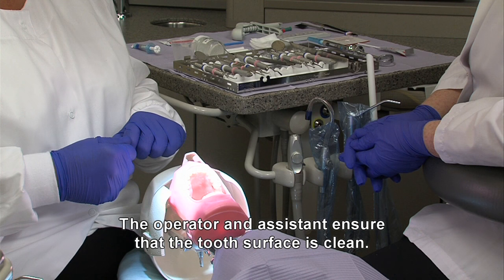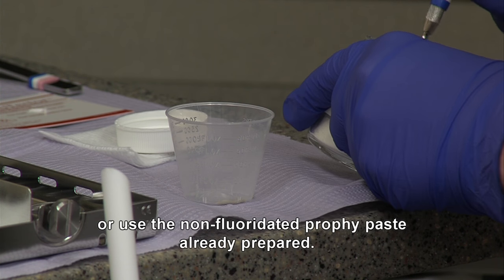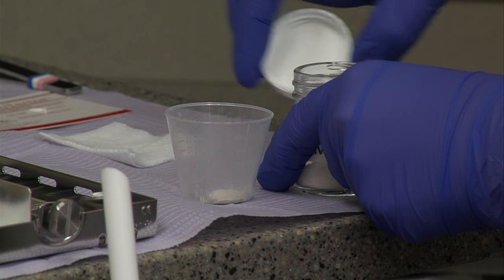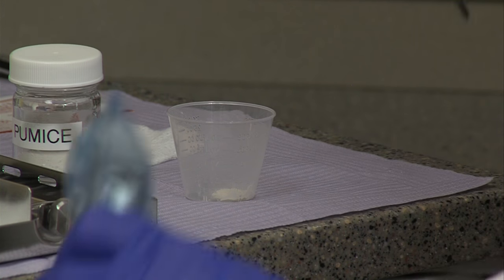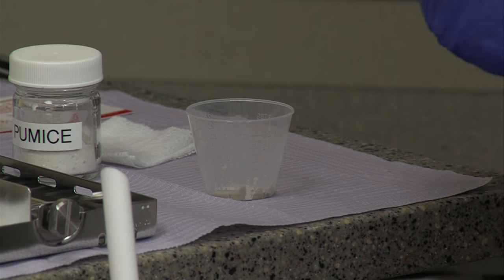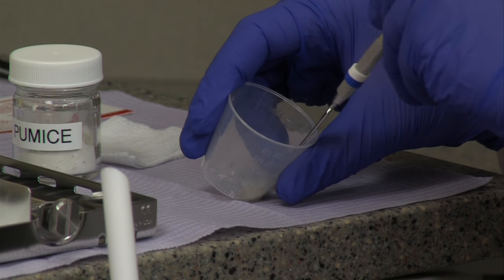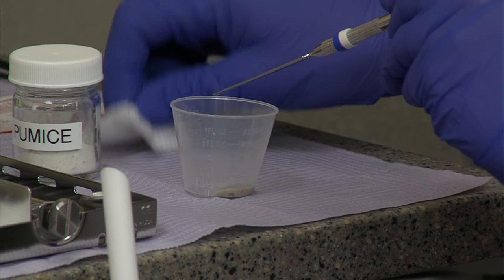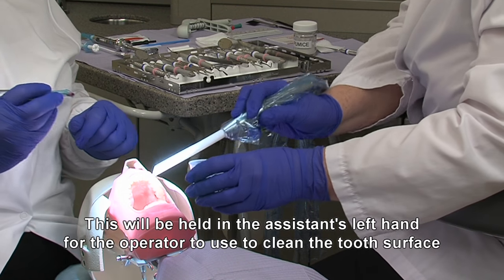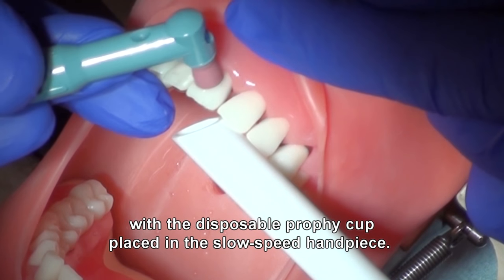The operator and assistant ensure that the tooth surface is clean. As required, the assistant will prepare the pumice in a plastic cup or use the non-fluoridated prophy paste already prepared. This will be held in the assistant's left hand for the operator to use to clean the tooth surface with a disposable prophy cup placed in the slow speed handpiece.